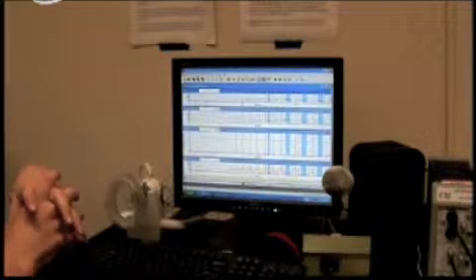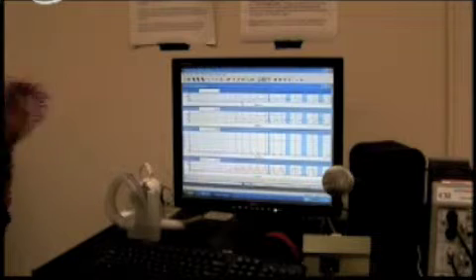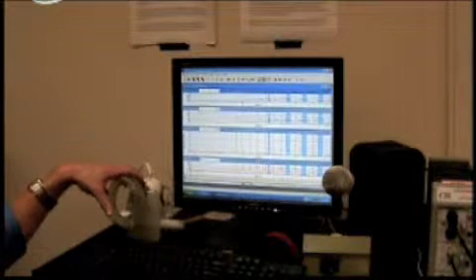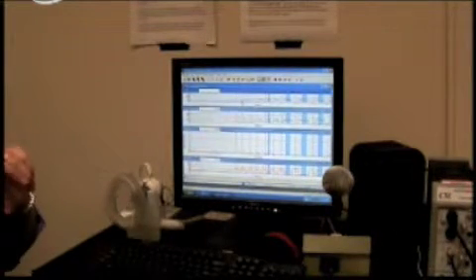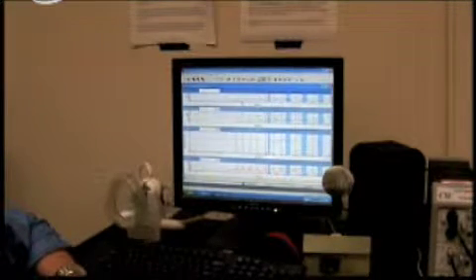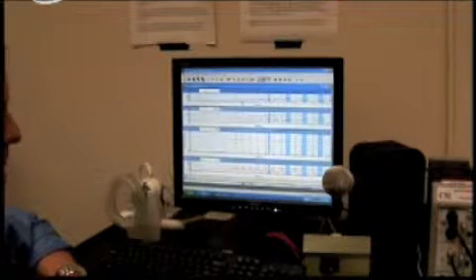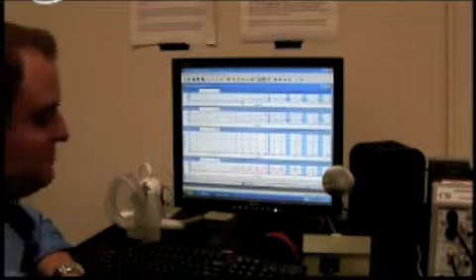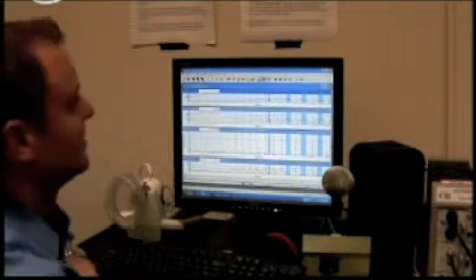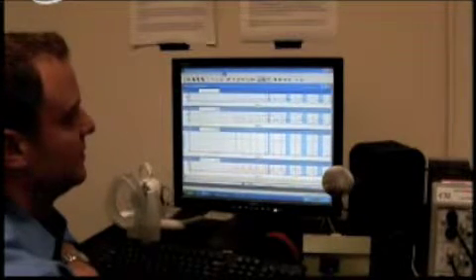So just a quick review — things to remember. Make sure it's plugged in. You got it at B here. You calibrated if it asks you to. And then you use the protocols, apply the threshold, and create your statistics. The job of the aerodynamic group is to make sure that the switch box is back on A when you're done, that you're unplugged, and the EGG is plugged in. That way, that's going to be our default for now until we work something else out in terms of the plugs.